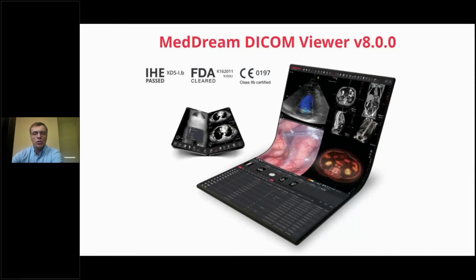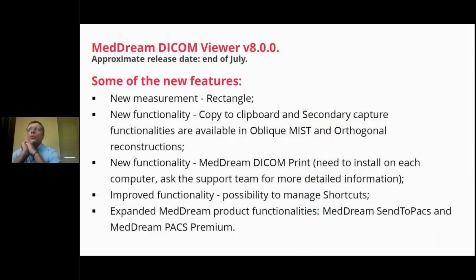It's expected in November, and with the certification we expect a lot of functionality coming, not only for mammo, but also for speed and related things.